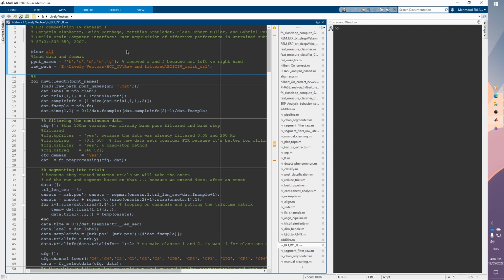I will be leaving links to the dataset if you would like to download it and test the code yourself and play with the code. I really like to explore with this, and I really encourage you to explore by changing the code and seeing the result yourself.